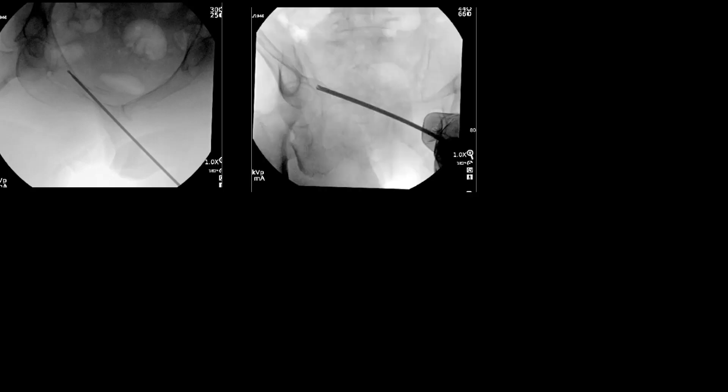This is the right side case for the rami. I'll do a retrograde insertion — I would do this with a screw starting closer to where the fracture is. I use the guide wire to get myself started; in this case a 2.8 millimeter guide wire, which allows me to direct and orient myself in two planes to get where I want to be.